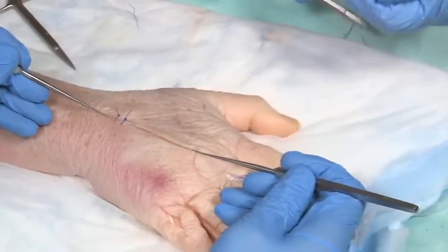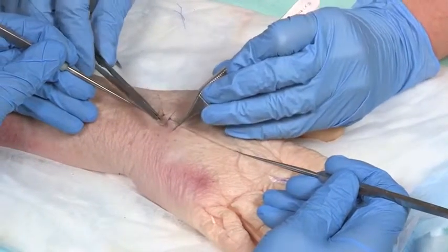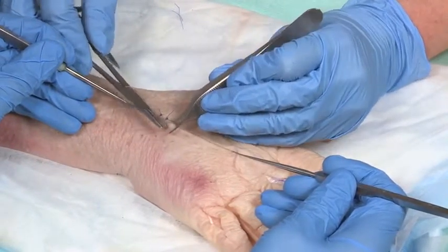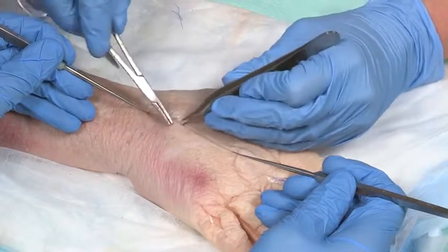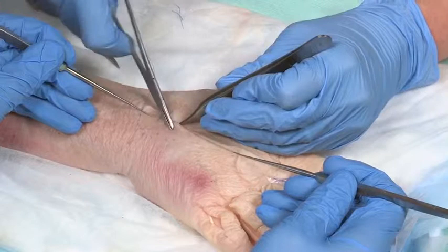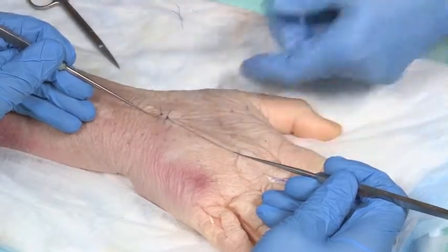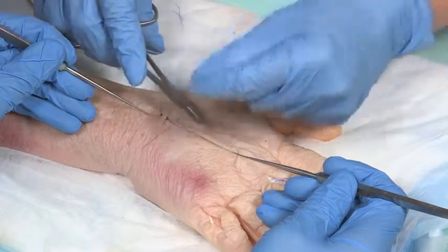Edema may occur following the operation, and so sutures should be placed to approximate the skin edges rather than tied too tightly. Hold the edges of the suture material together and vertically to enable a colleague to cut the suture material for you, or to cut it yourself with the suture scissors.